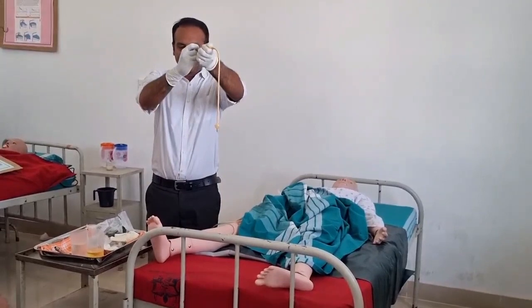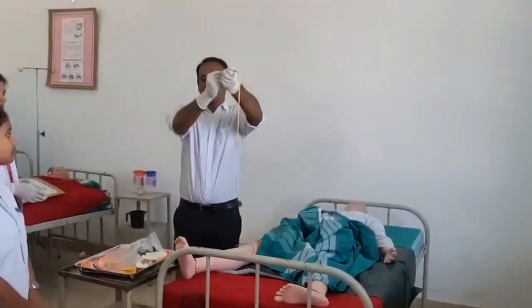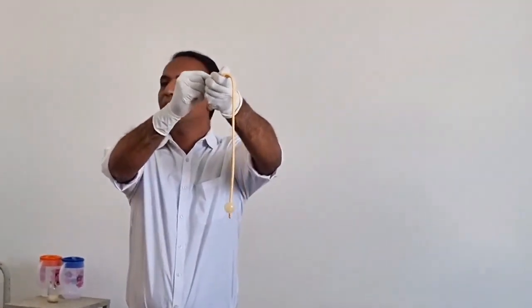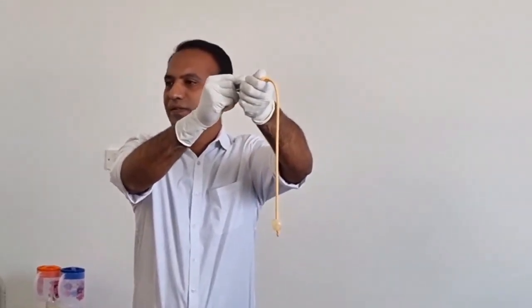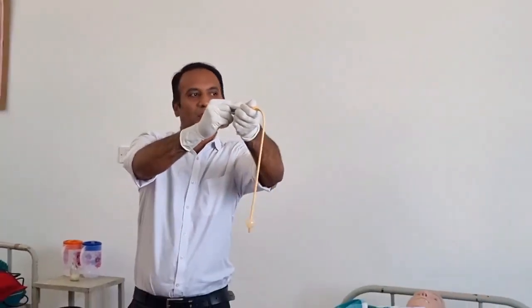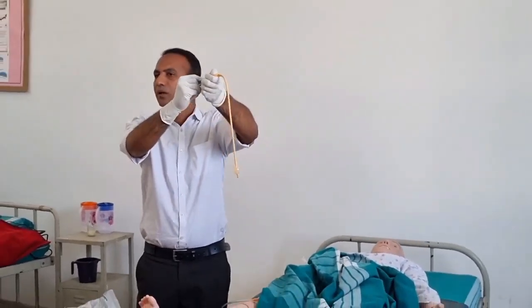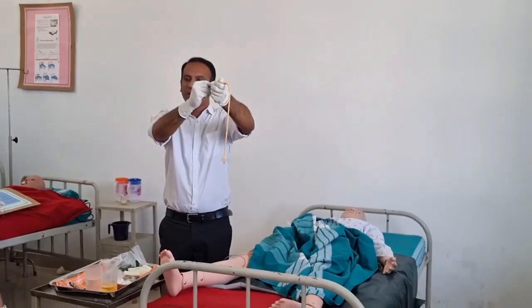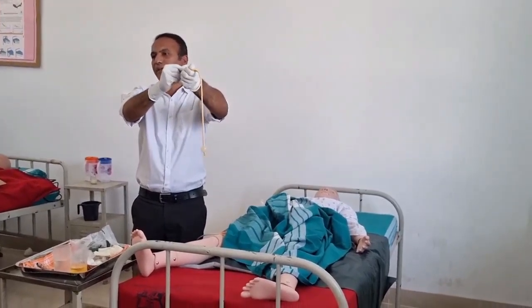Can you see? See, now the balloon is inflated. So what is the idea behind it? This will hold the catheter in place within the bladder. If the patient moves side to side or makes some other body movement, the catheter will not come out. Understand? So this is the idea in a Foley catheter. Usually it will be there for 3-4 days at least.